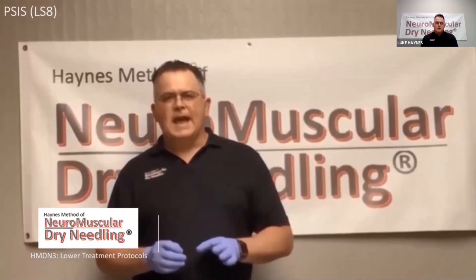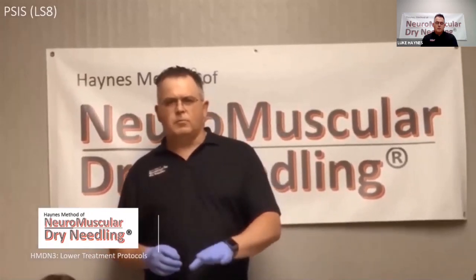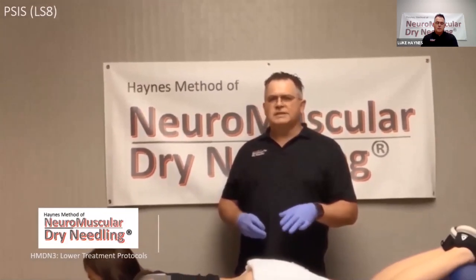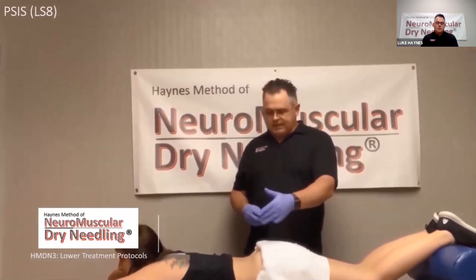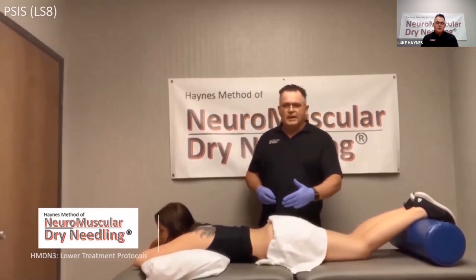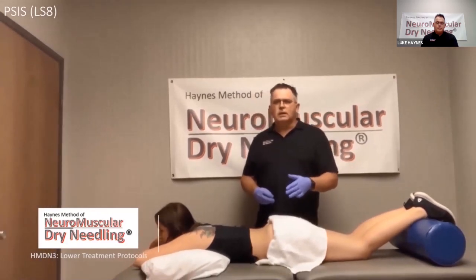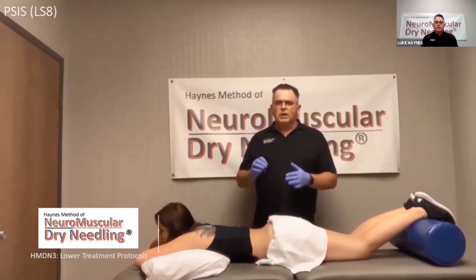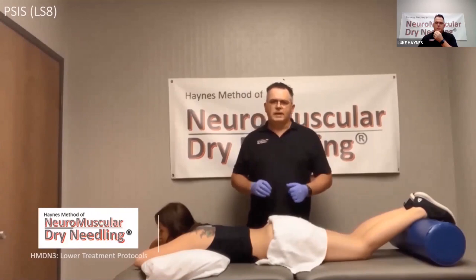For the PSIS, obviously, the patient's going to be in the prone position. Needle length here, 3 to 5 centimeters, depending on patient's habitus. Backdrop, obviously, is the PSIS. We're going to palpate the vertical length of the PSIS, and we're going to use the needle to needle through the connective tissue and peck on the periosteum, locating 2 to 3 different areas on the PSIS.